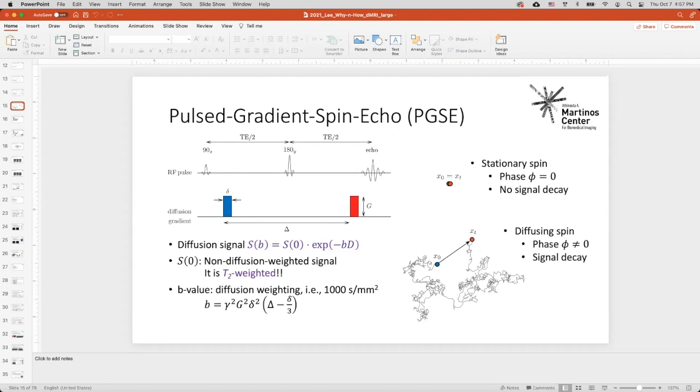Yeah, so you mean like a high resolution image in the gray matter? Yeah, so because obviously diffusion imaging really excels in white matter, but when it comes to fine structures in gray matter, it usually struggles. Right. So I remember like 3-4 years ago, people still saying that, oh, we shouldn't do diffusion measurements for gray matter. But now everyone's doing diffusion measurements in gray matter.